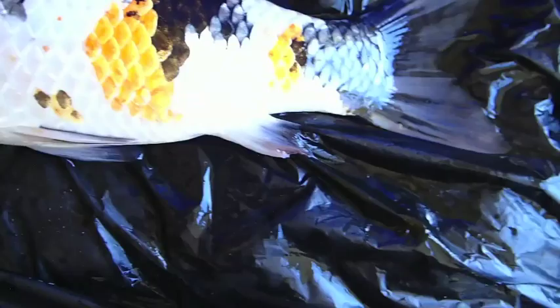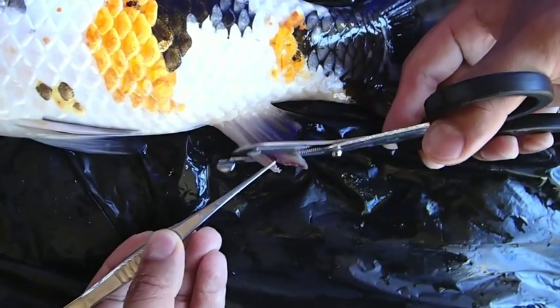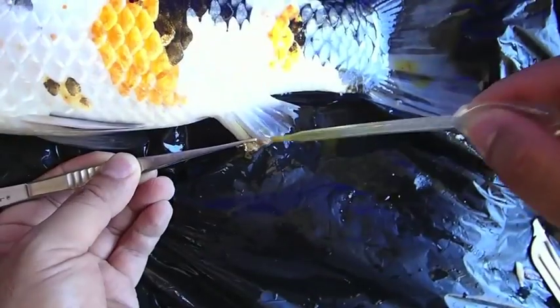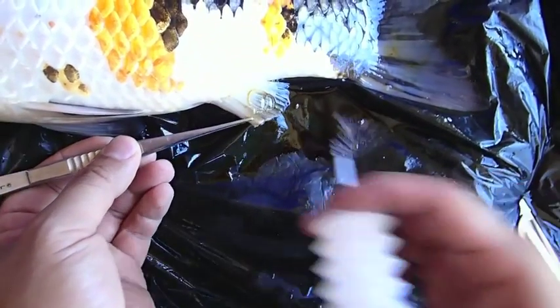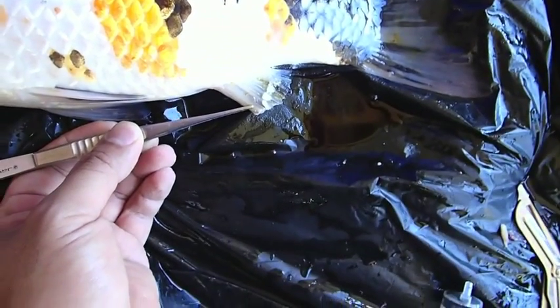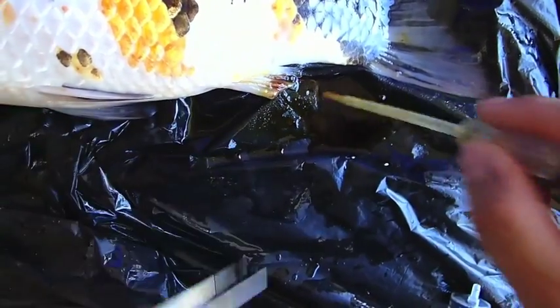So here, this fish has some fin damage. We have the fish under anesthesia and we trim the affected portion off. After that is done, we apply some topical betadine, which is diluted 1 in 10, and apply this powder gel. This cellulose-based compound will enable the medication to stay on the site for a few hours.